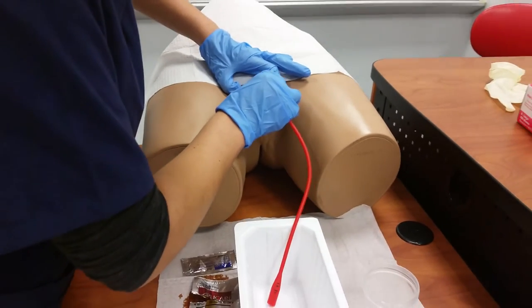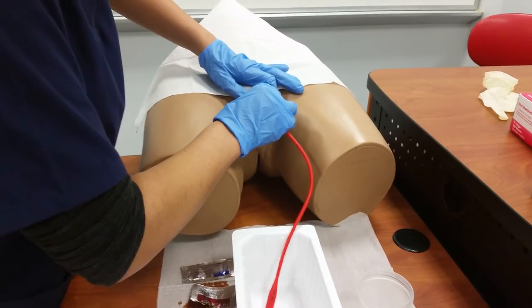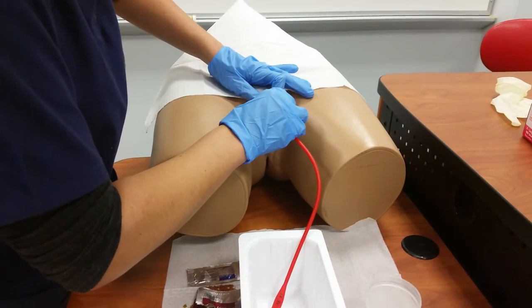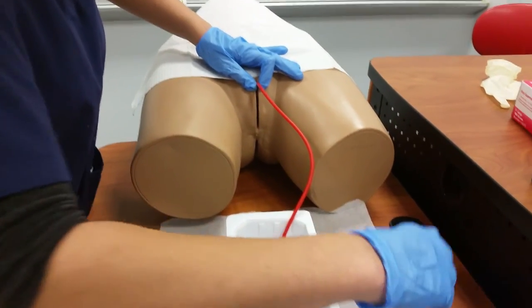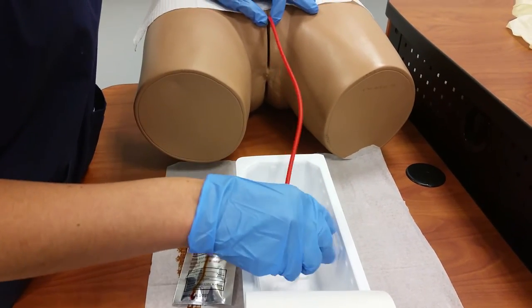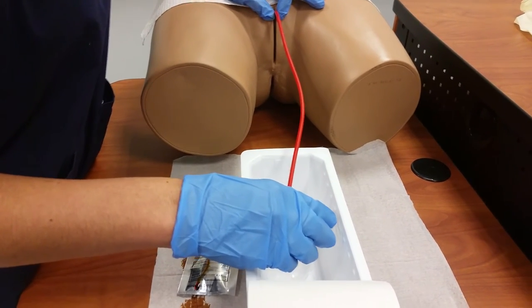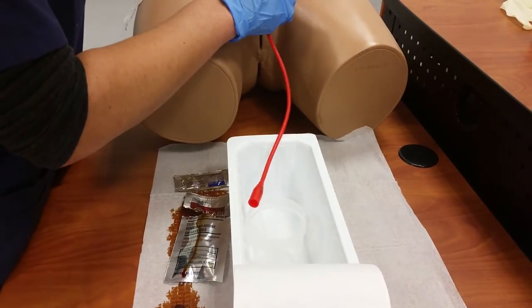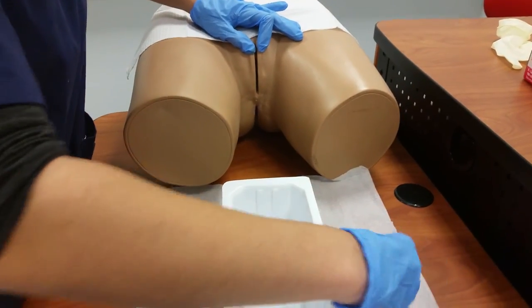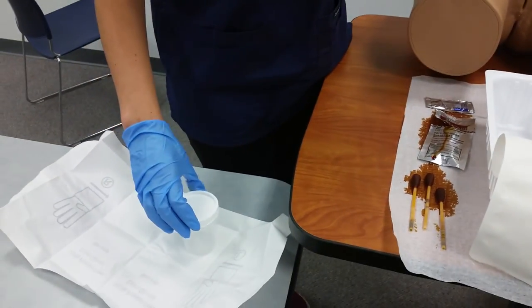I would keep inserting the catheter until I saw urine come out of the catheter, and keeping my hand on the catheter that is now contaminated, I would then place my catheter in the cup and catch a urine sample midstream until the patient stops urinating. From there, I would take out the catheter and dispose of it. And I would put my cap on the clean urine sample.